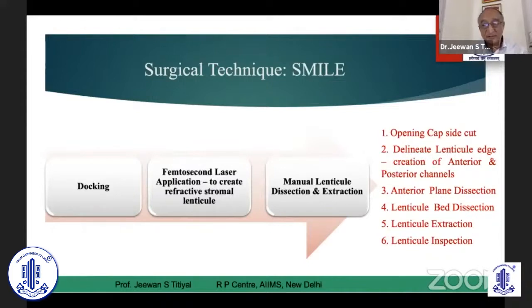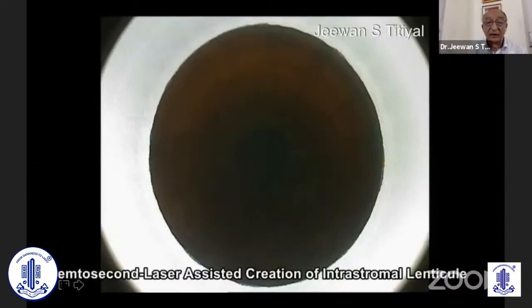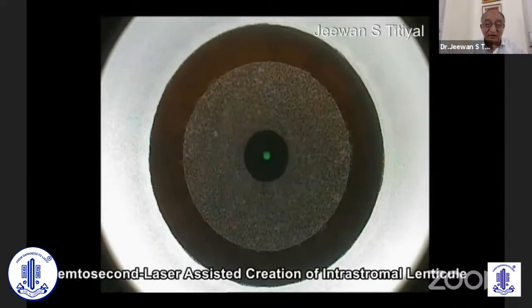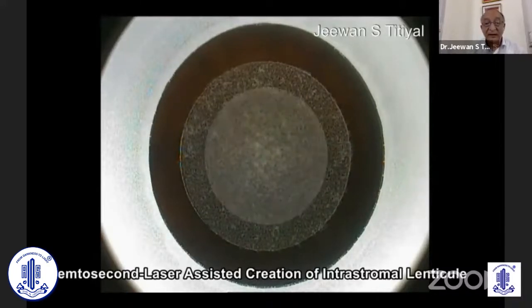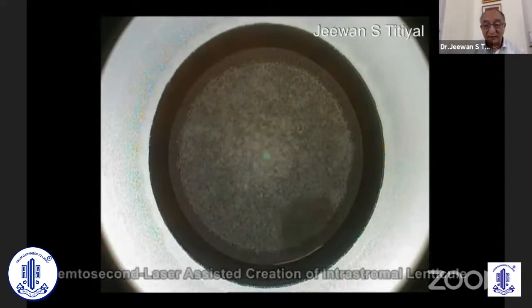These are very simple steps which are not going to make a huge difference in terms of the timing of surgery. As nicely described by Dr. Graywal, comparing LASIK and SMILE, let me show some small video clips to show how effectively we can do it. The first is the application of femtosecond laser to create the intrastromal lenticule. You can see that we have created the side cut now, and now we'll be creating the cap, which is coming from center to periphery. The entire procedure takes 22 to 28 seconds, depending on laser energy.